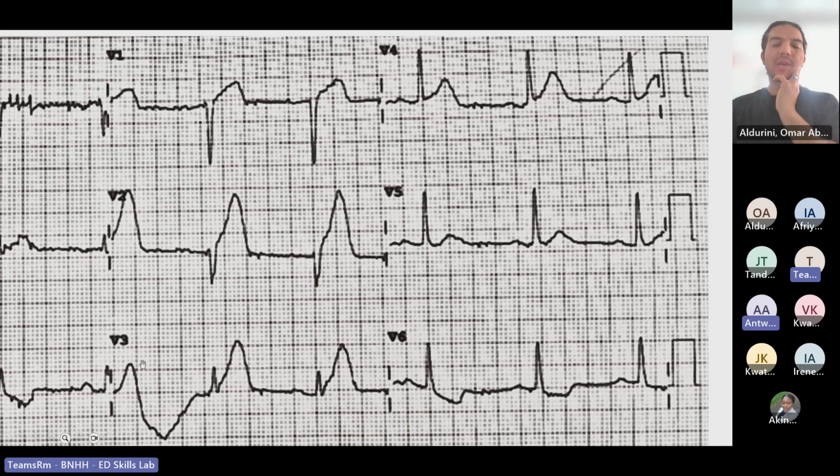Okay, because the patient might just breathe or the lead might just move, and it will give you this line, which is not a good thing, but sometimes it happens. We have to take a very good, clear baseline that we can judge upon. So that one too is not clear.